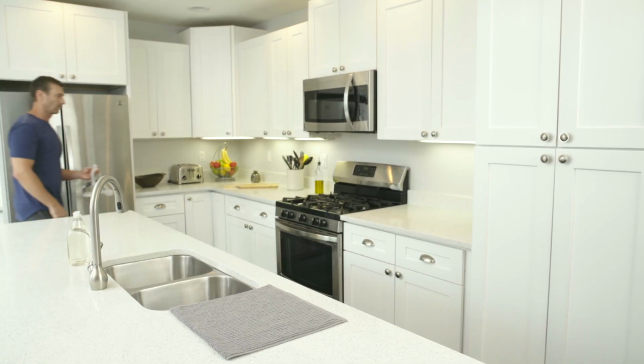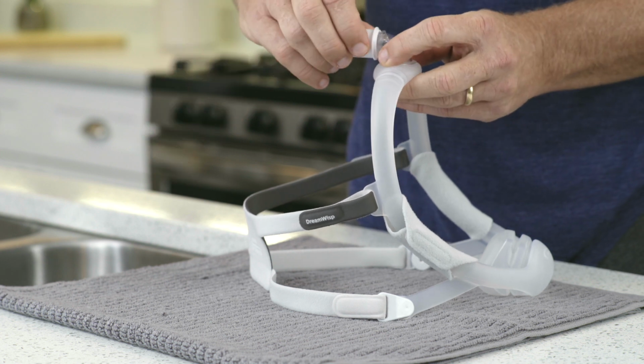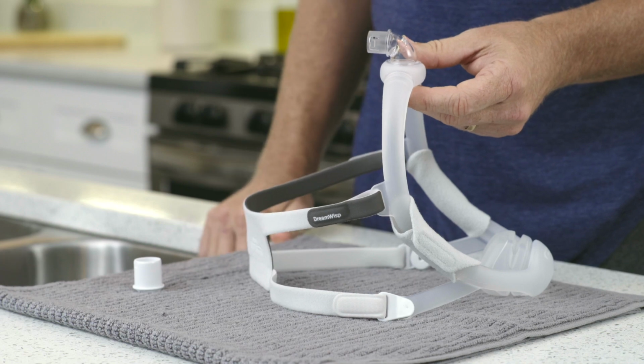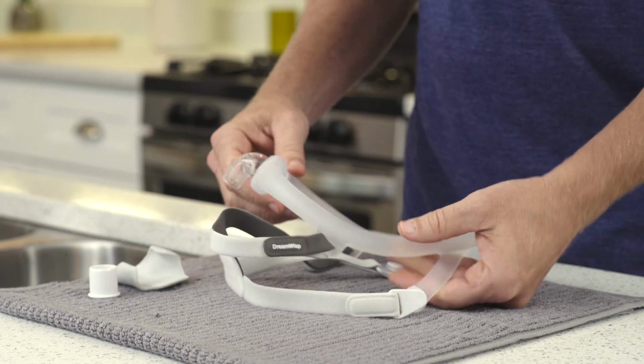Cleaning the Philips DreamWisp Minimal Contact Nasal Mask regularly and before first use is very important. To disassemble, pull the quick release from the elbow or CPAP hose. If you're using the optional fabric sleeves, undo the strips and remove them from the mask frame.